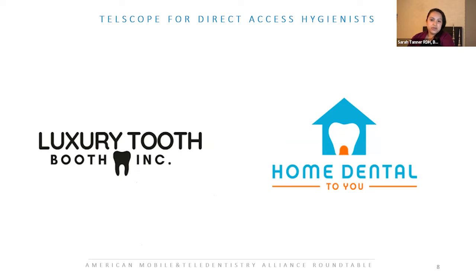Yeah, so I've used Teledentix since April. I've kind of established my own platform to what I want. It's been nice having the support from not only Michelle, but Daniel as well as James to establish what would be best for me here in Colorado as a mobile and teledentistry platform for the broad spectrum: Denver metro area, possibly the slopes, things like that, making myself as available as possible to where it can be utilized.